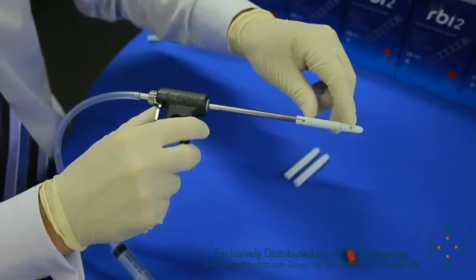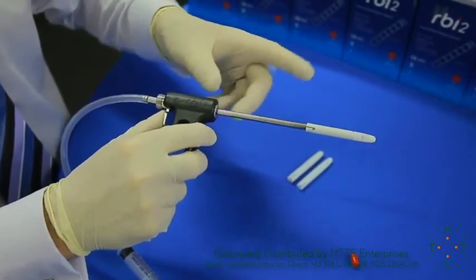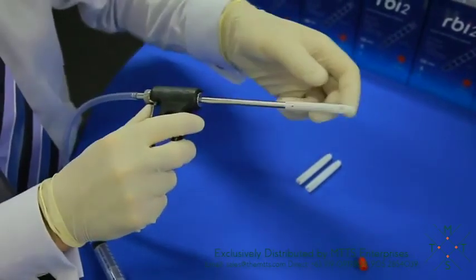So then once you've taken the biopsy, your syringe will be left into the neutral position and you'll withdraw from the patient.